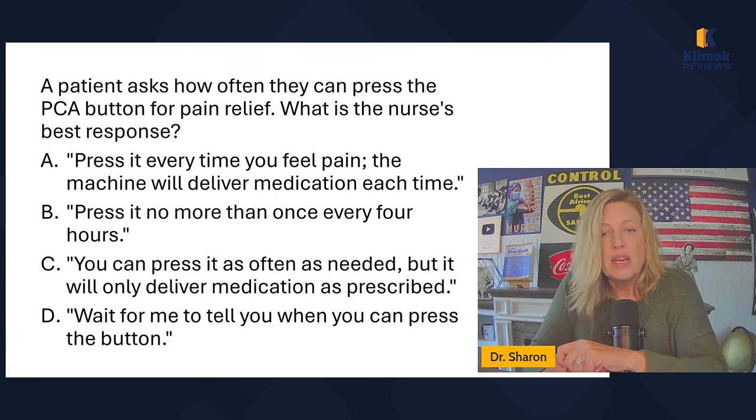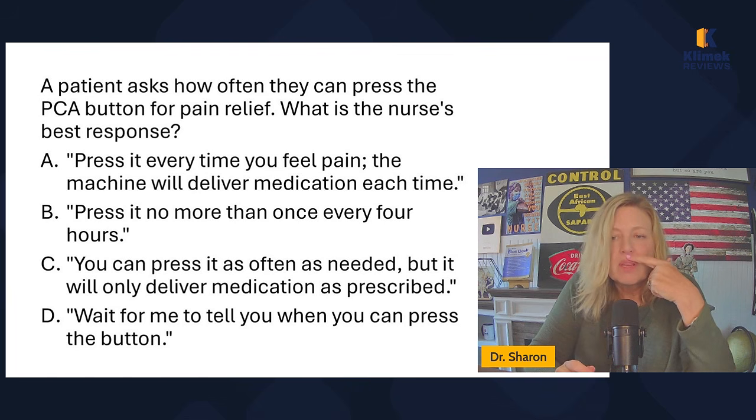A patient asks how often they can press the PCA button for pain relief. What is the nurse's best response? So a best response means I'm looking for the best answer out of all the answers we have here. Press it every time you feel pain. Yes, the machine will deliver medication each time. I like it, press the button every time you feel pain, but that doesn't mean the pump will deliver it each time. So I'm not crazy about A.